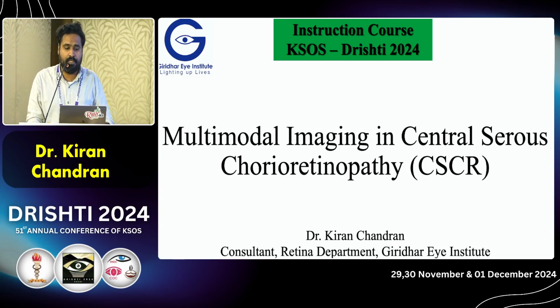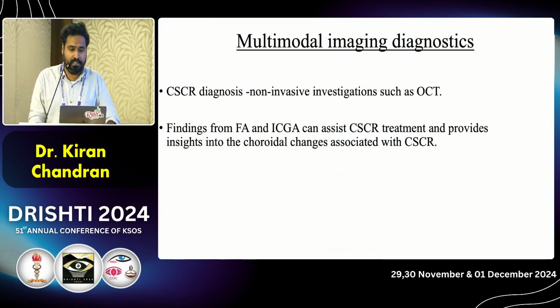I'll be talking on multimodal imaging in CSCR. CSCR can be diagnosed clinically, and even non-invasive modalities, especially the commonly used OCT, can be enough to diagnose a case of CSCR. But additional multimodal imaging using FFA and ICGA can assist in CSCR treatment modalities and provide insights into the choroidal changes also associated with the disease.